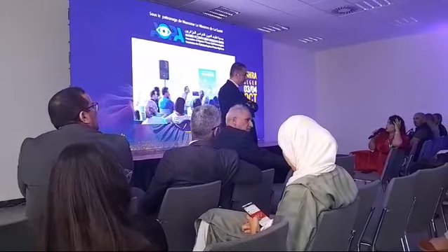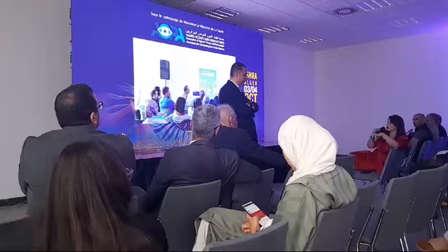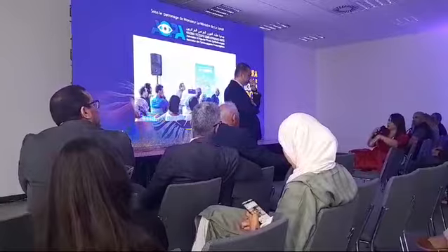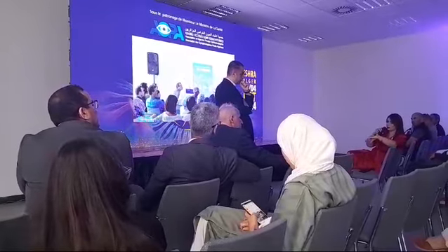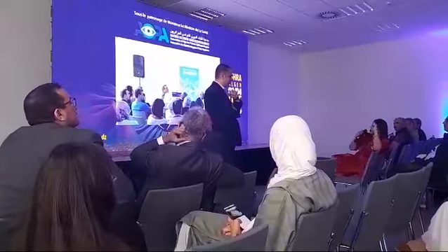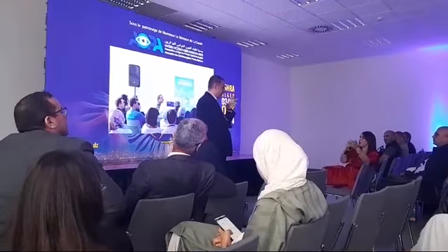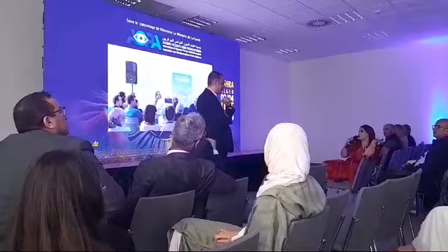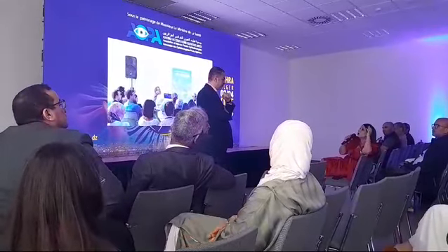But retinal detachment, I think it could be because of the pressure of the suction ring, which could, in theory, elevate the pressure, and when we treat high myopia or moderate myopia, they can have retinal degeneration, and we have retinal detachment.